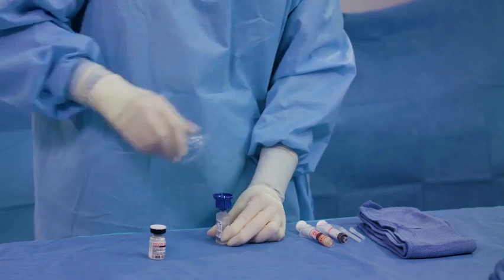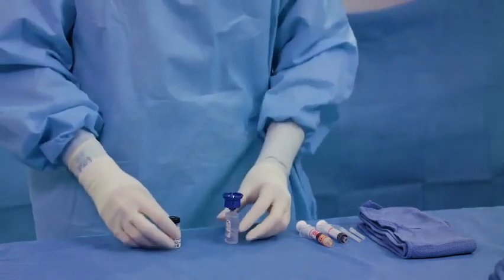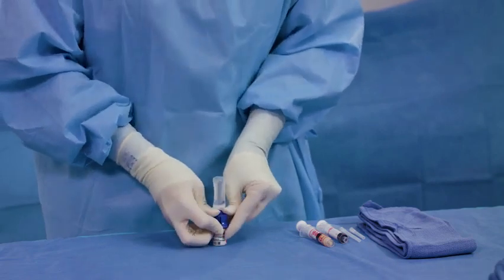Remove the adapter from its packaging. Remove the plastic flip-off cap from the thrombin vial. Place the vial on a flat surface in the sterile field. Pierce the rubber stopper of the thrombin vial by pushing the vial adapter downward.